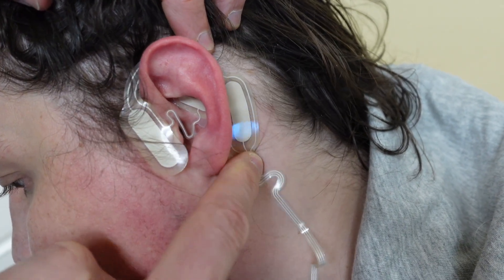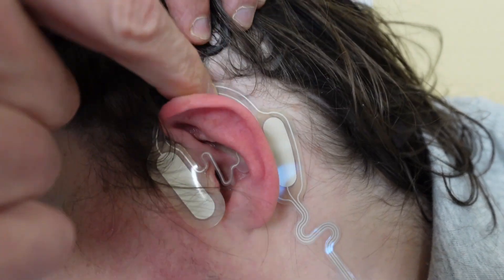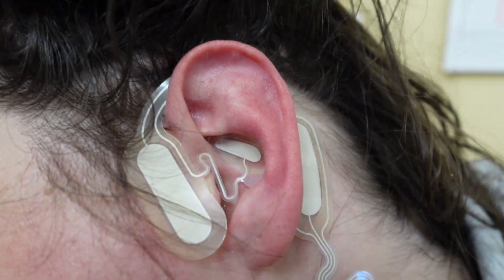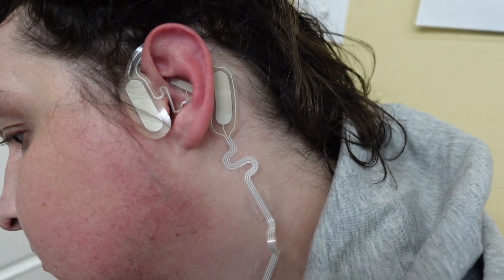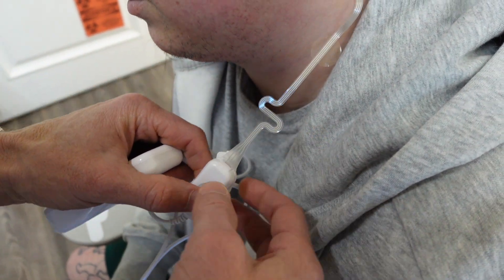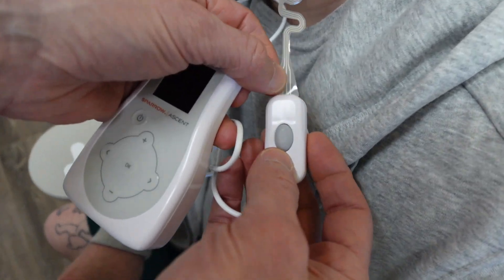It doesn't pierce the skin. The Bridge device had little needles, like you're getting your ear and face pierced every time you put it on. So this is a much better, much more comfortable device. We're just plugging it in — the earpiece plugs right into that little cable grasp. There are multiple points of failure on this device, and maybe that's why the patient had issues with error codes.